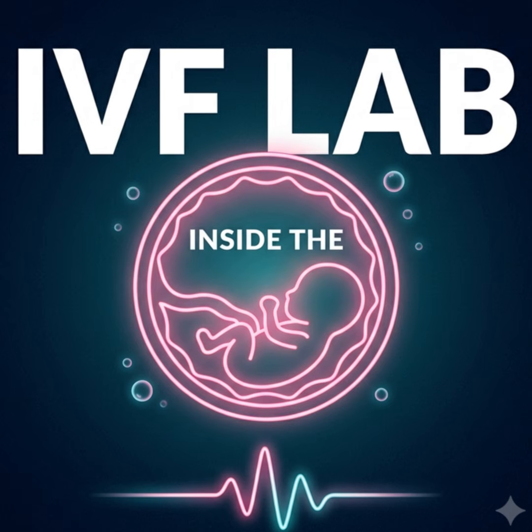study design. You would have to design a study where embryos are kept in a time-lapse incubator but the cameras are turned off, and compare them to embryos in a time-lapse incubator where the cameras are on to isolate the visual variable. Until we can cleanly separate these factors, the debate over the ultimate clinical utility of the visual data will continue.